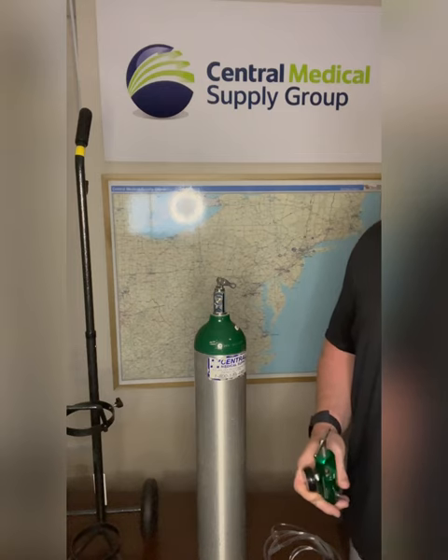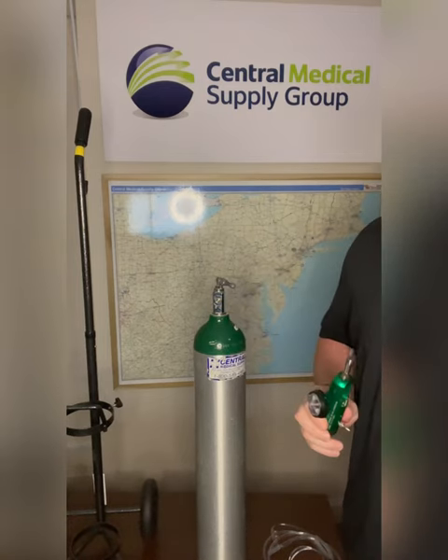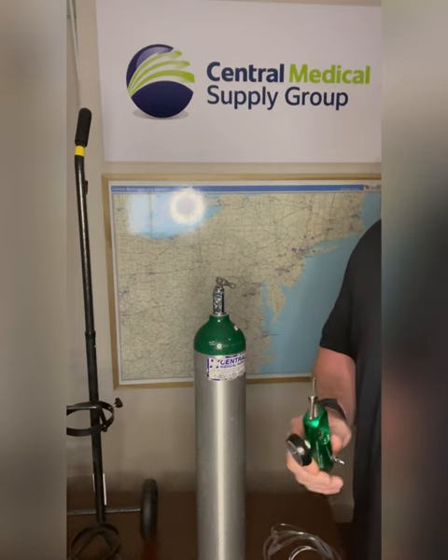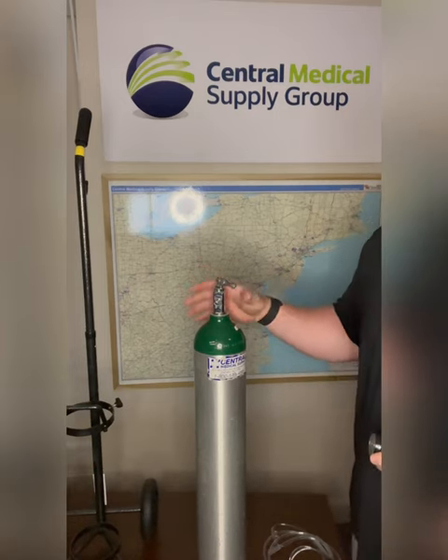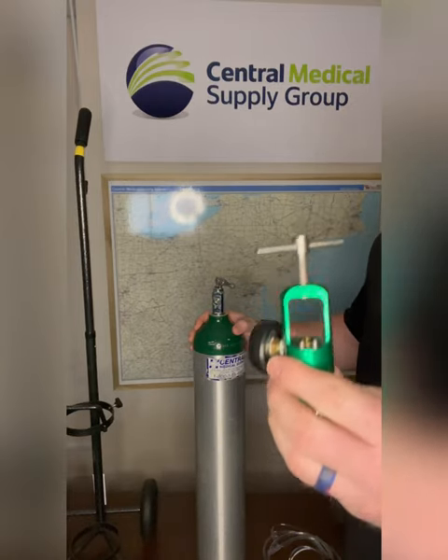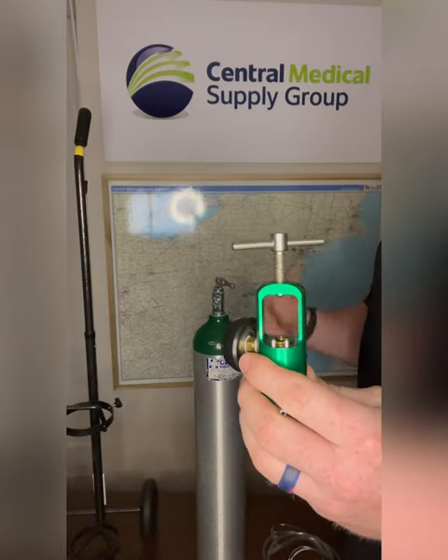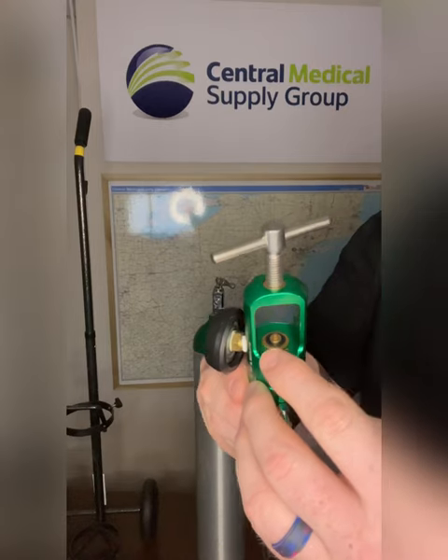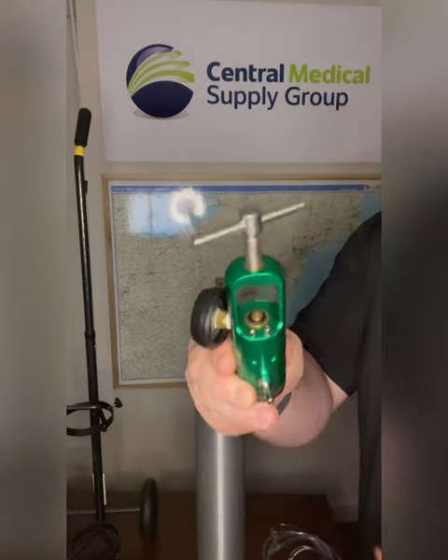Our backup tank will also come complete with an adult regulator. To put the regulator onto the tank, you must first ensure that the backup oxygen tank is securely positioned and stable. Inspect the regulator and ensure that it is in good condition without any visible damage or defects. Most importantly, the O-ring inside must be in place to work properly.